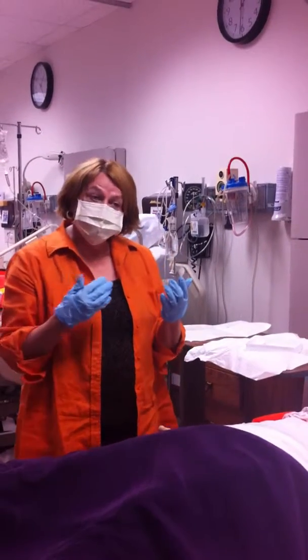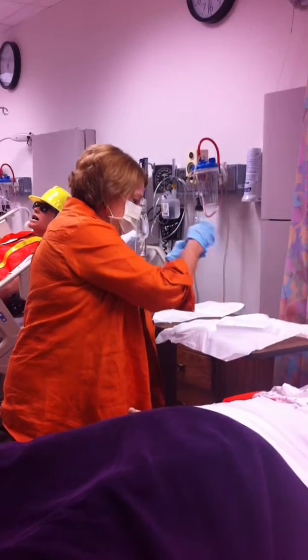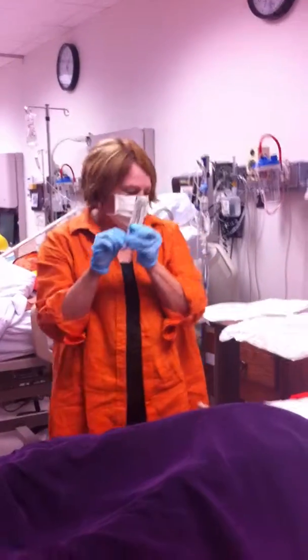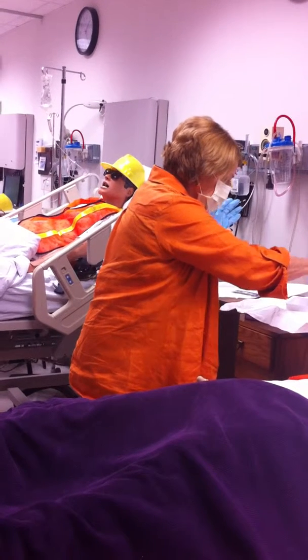If there is blood or dried exudate on the insertion site, you would want to clean with this alcohol and this Q-tip first. Ours is remarkably clean, so I'm just going to put these over here. Drop, don't place. And I'm going to use the chlorhexidine.